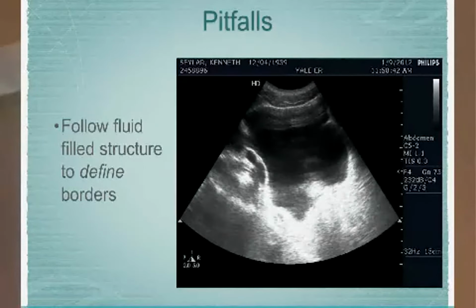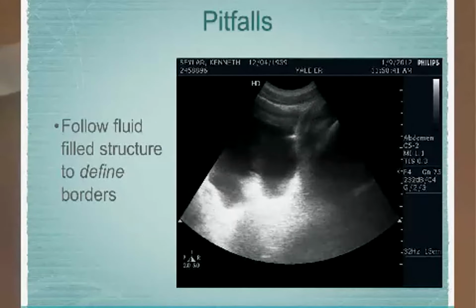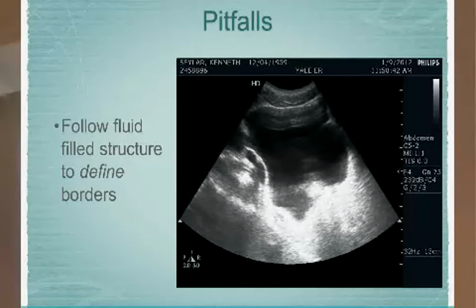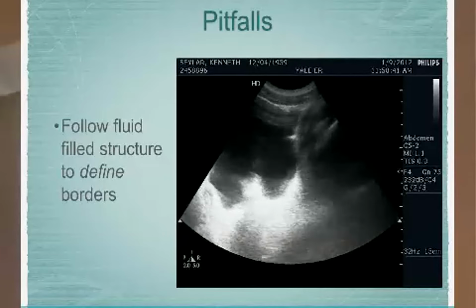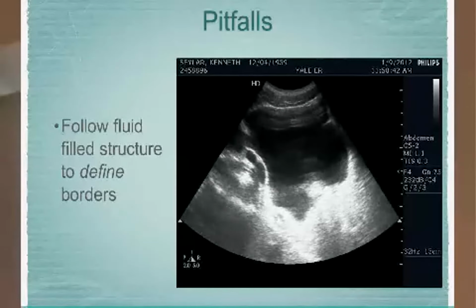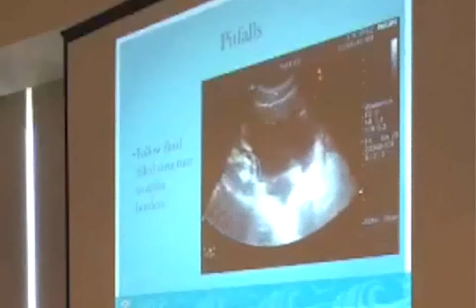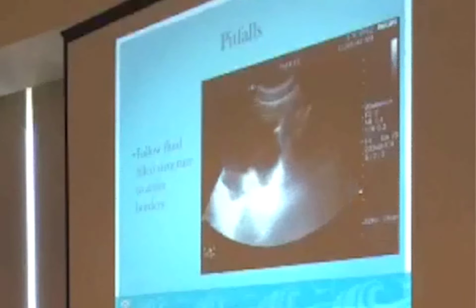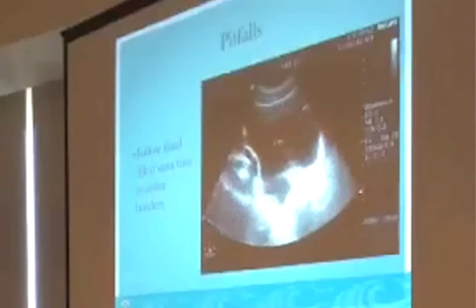Fan all the way through the organ that you're interrogating, because you could put your probe on here and right at the beginning of that clip you could say, oh, that's a normal transverse bladder. It's got that rhomboid shape. I'm cool. I don't see a lot of fluid down here around it. But if you fan all the way through and look for that nice rhomboid bladder to close itself off and be well contained, you won't find it, because this is actually free fluid just sitting in the pelvis, and the pelvis is kind of rhomboid shaped, and you're mistaking the iliac crest filled with fluid for a bladder.